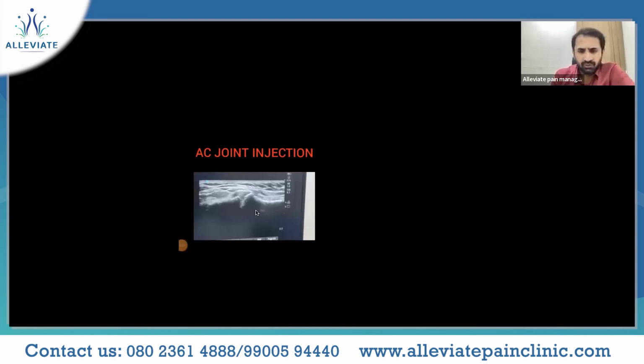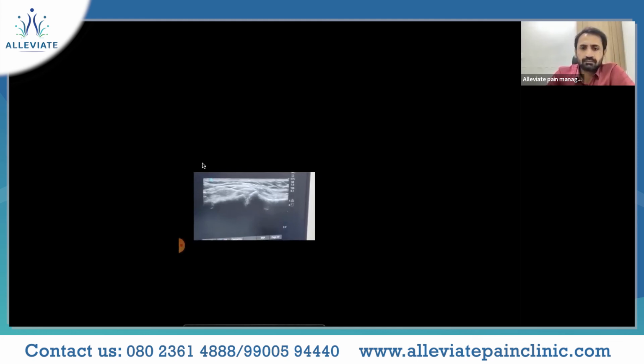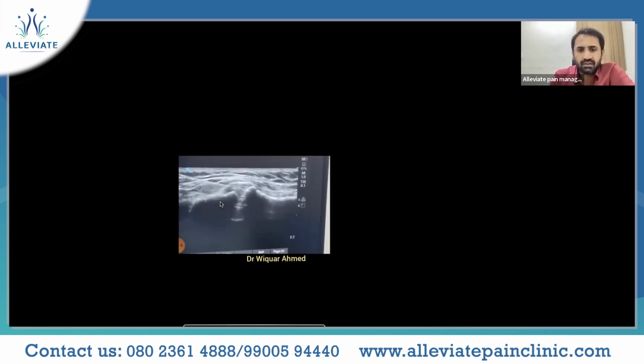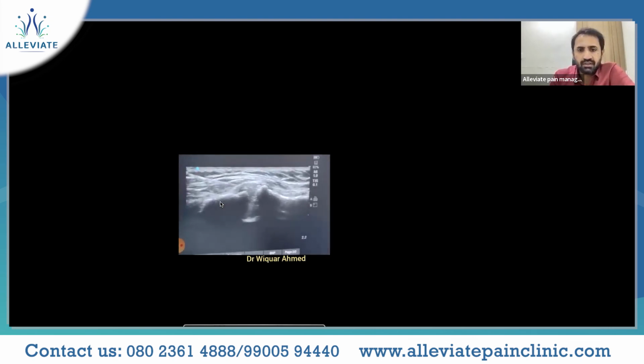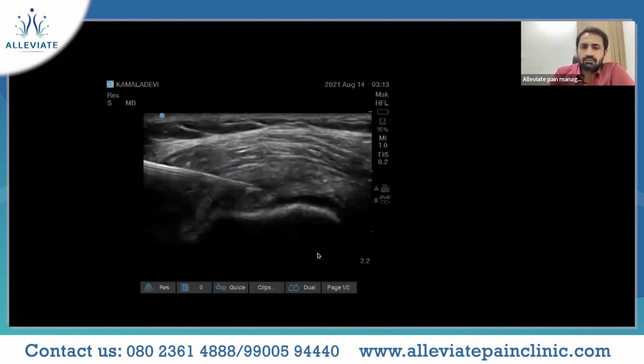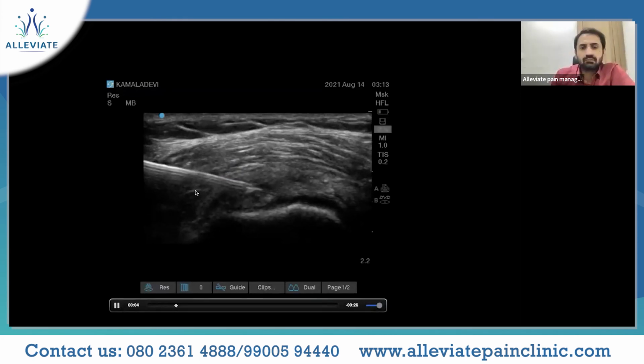These are a few interventions. You can see this is joint needling in this. You can see the joint being beautifully opened up. This is again in-plane needling of the supraspinatus, partial thickness tear. Supraspinatus needling, quite a common pathology, but quite painful.